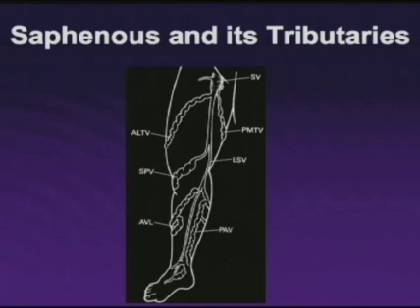In evaluating the patients for chronic venous disease, we concentrate in particular on the saphenous veins, both the great saphenous vein and the small saphenous vein, but also want to evaluate any sites of symptomatic varicosities, which may be in the tributaries of the veins, such as the posterior medial branch or the anterolateral branch or other branches of the saphenous vein. Here in this image, we can see the saphenofemoral junction and the saphenous vein as it's coming down. The saphenous vein may be varicose itself, or the varicosities may lie within the tributaries of the vein.